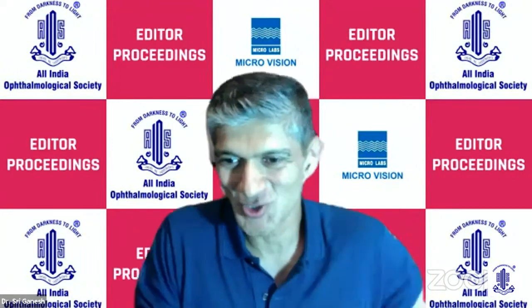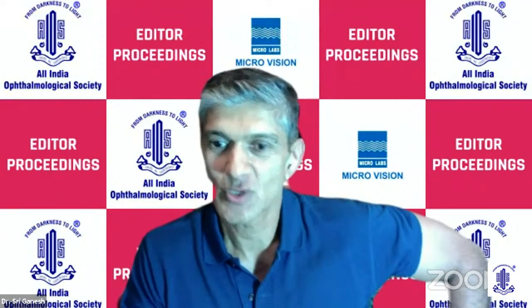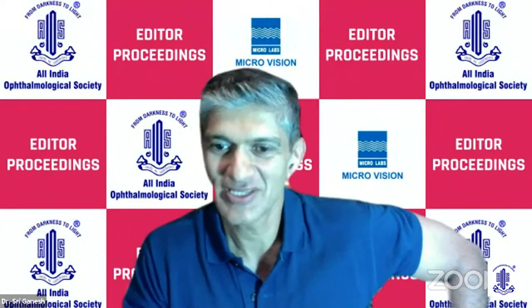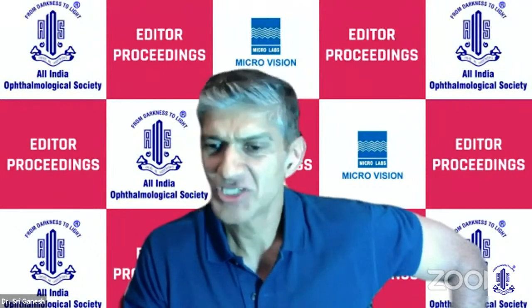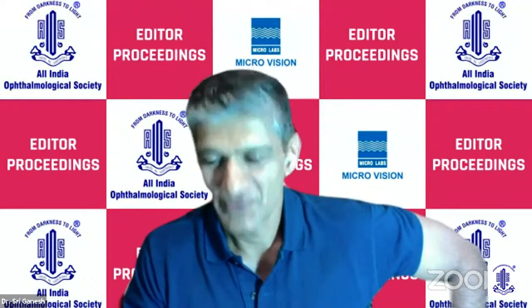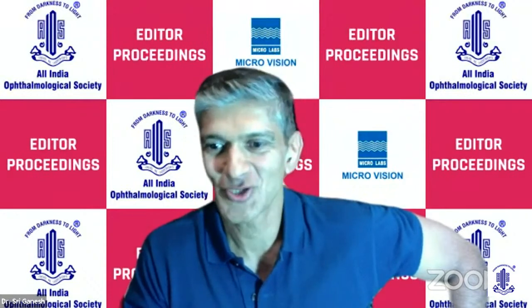I'll tell you a story which is very interesting. With an Indian manufacturer, we got a lens, and we were getting results which were totally off, only with this lens. All the other lenses were fine. Only with this lens, it was totally off, like 1.5 diopters off. And then we checked everything. We checked our biometry, and everything was fine. And then we went back and investigated, and finally we found out the source of error.